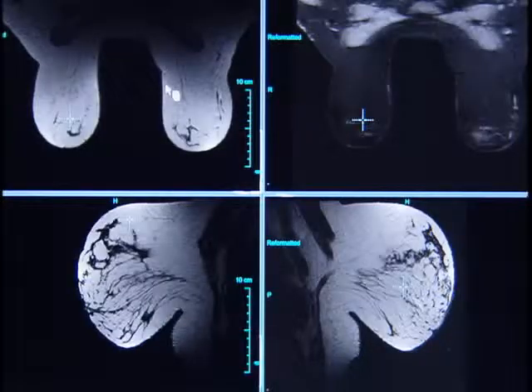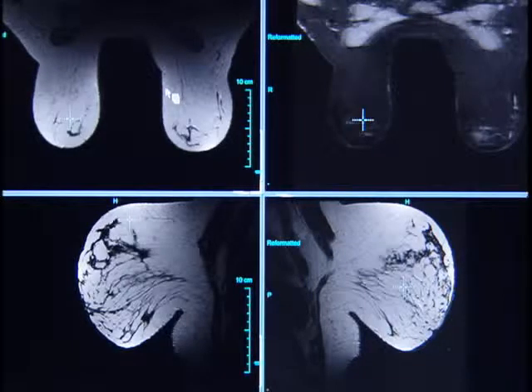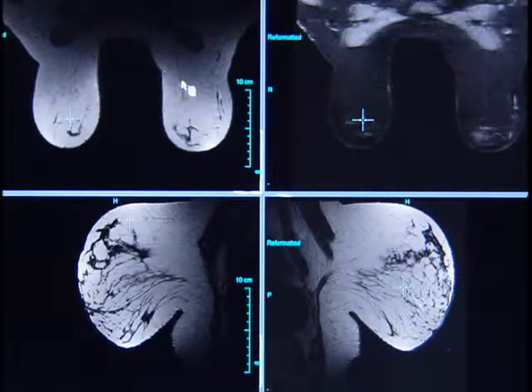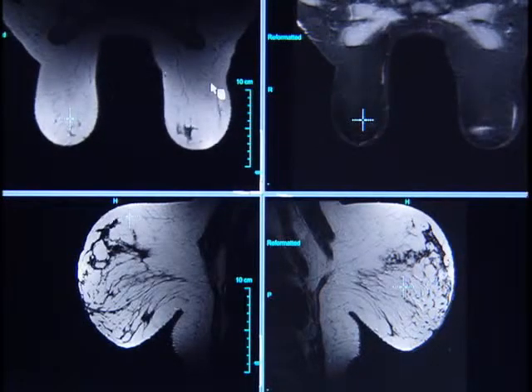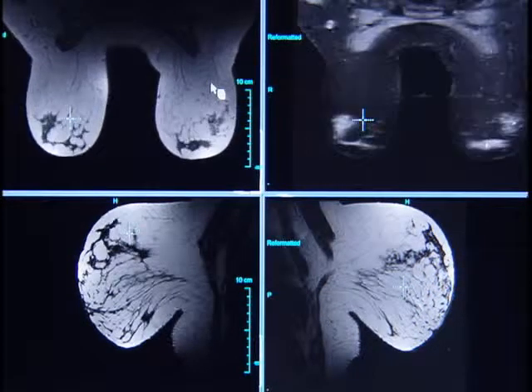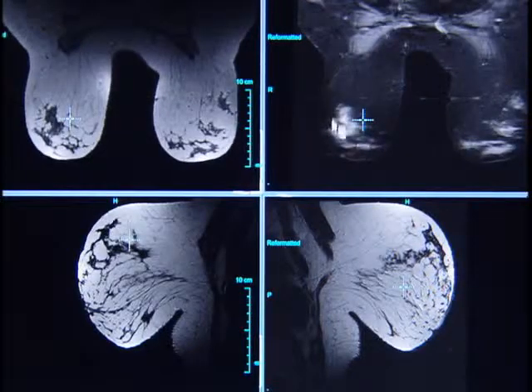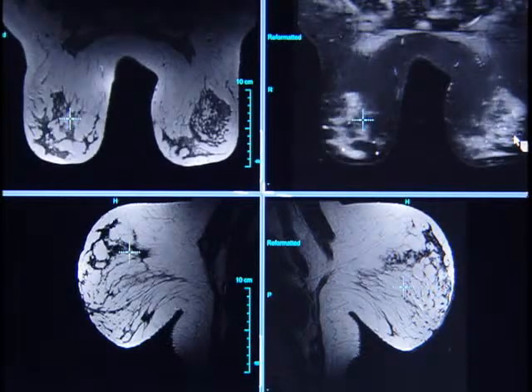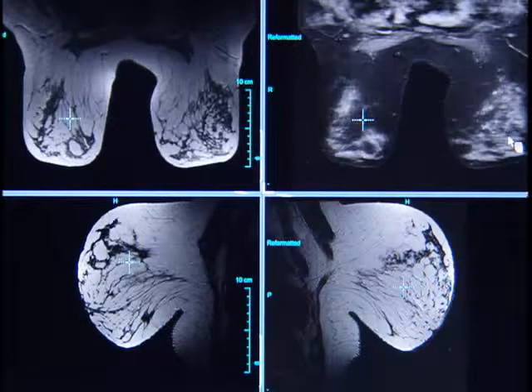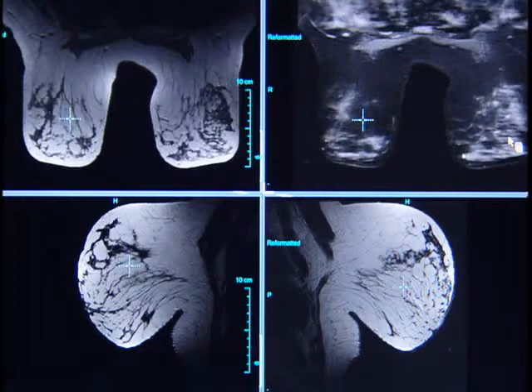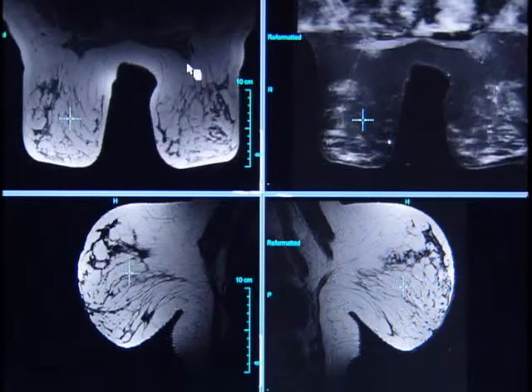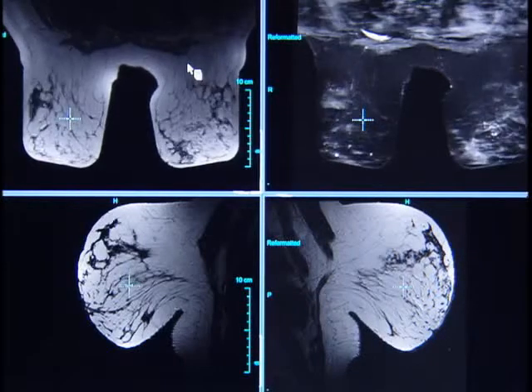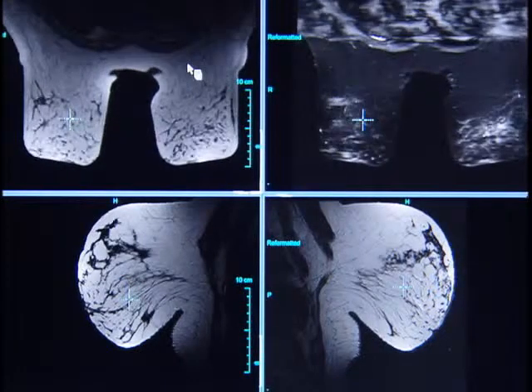The next pull-down option in this hanging protocol utilizes a dual monitor display. On the right-hand monitor, we have our precontrast T1 and STIR images. This allows for a survey of the breast parenchyma assessing density and amount of parenchyma, as well as assessing cysts, parenchymal and skin edema, as well as lymph node morphology both in the axillary regions and in the internal mammary lymph node chains.